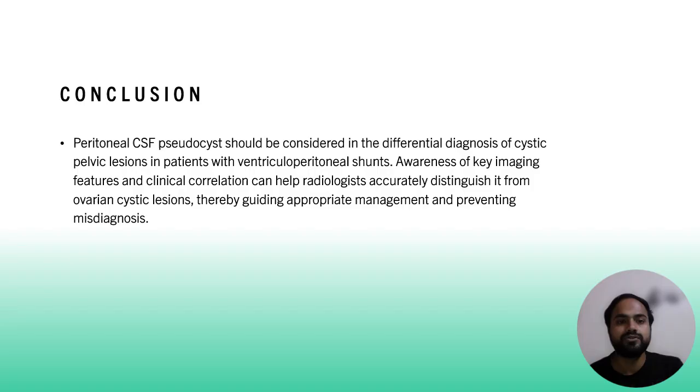Therefore, peritoneal CSF pseudocyst should be considered in the differential diagnosis of cystic pelvic lesions in patients with VP shunts. Awareness of key imaging features and clinical correlation can help radiologists accurately distinguish it from ovarian cystic lesions and thereby guiding appropriate management and preventing misdiagnosis.